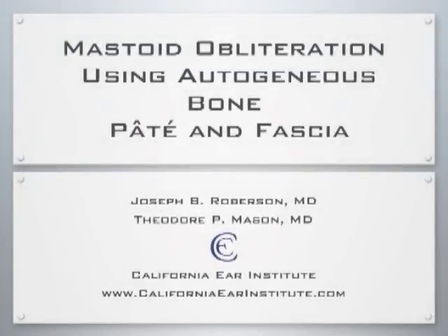Welcome to Mastoid Obliteration using Autogenous Bone Pate and Fascia. We will detail a six-step process to allow successful mastoid obliteration in anticipation of second stage transcanal ossicular reconstruction.